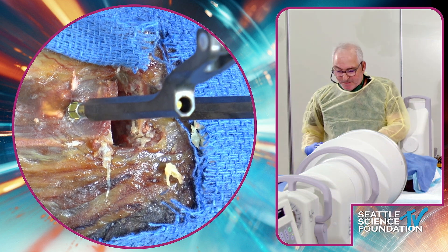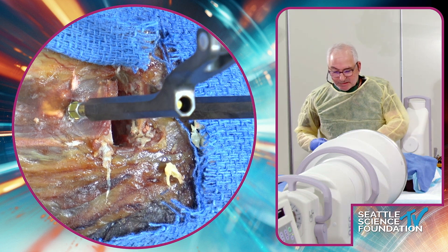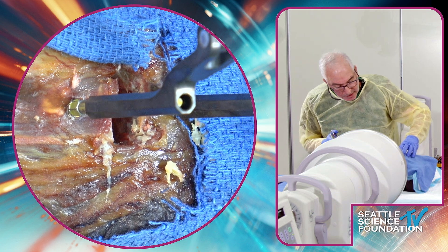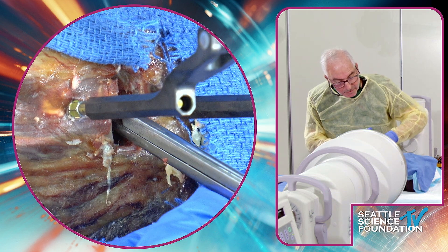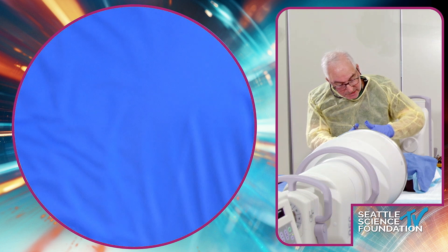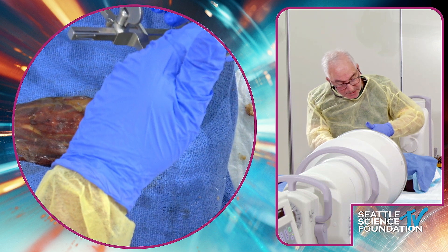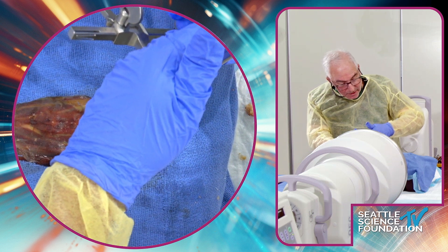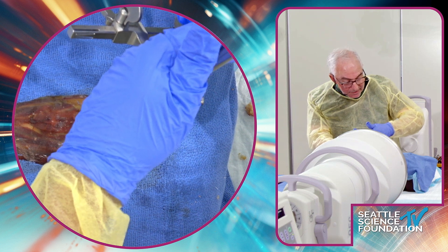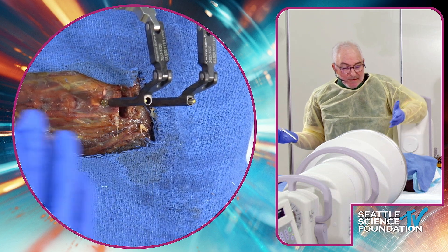If there's any fibrous tissue back there, depending on where the original disc surgery was done, sometimes they didn't do as thorough a discectomy as you might. You can always go and do more foraminotomies, take the scar off in front of the epidural space if needed. It definitely is not as adhered as it is in lumbar, so it doesn't seem to be as much of a problem.